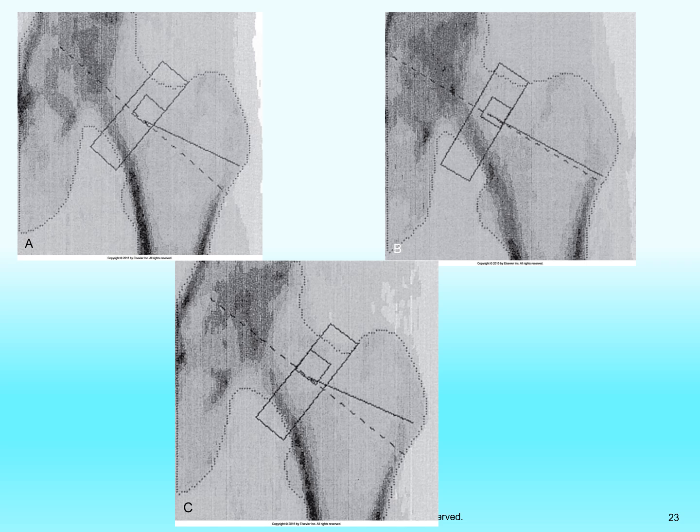Okay, so now that you understand precision and accuracy, one of these measurements was done incorrectly. It's a different result. Okay, so which one of these measurements was done? This is the targeting system for your bone densitometry for a hip. A was done 6 months ago. Which one is going to give you a precise measurement, B or C?